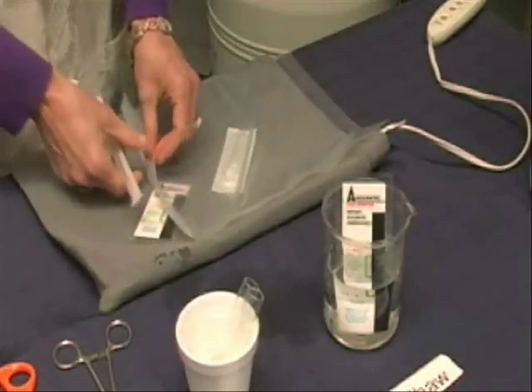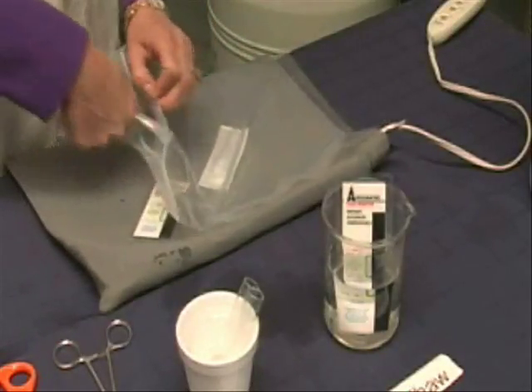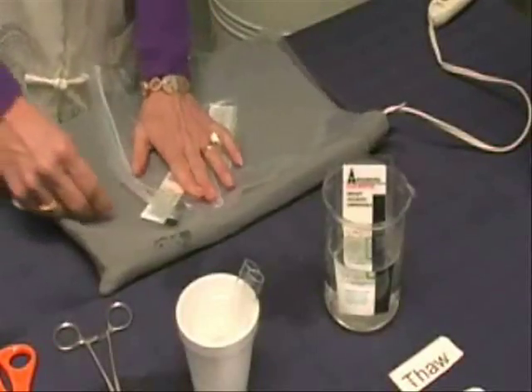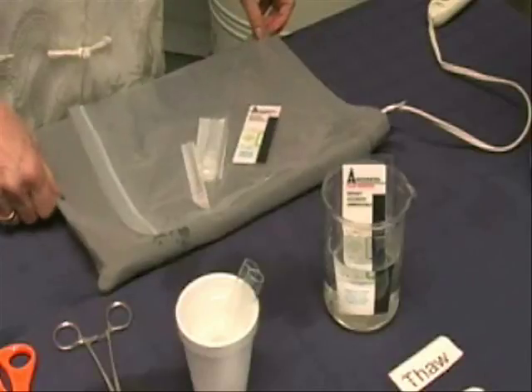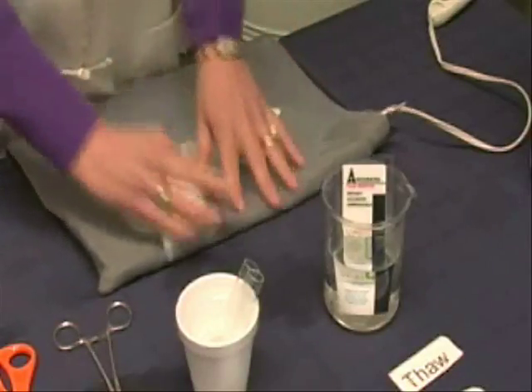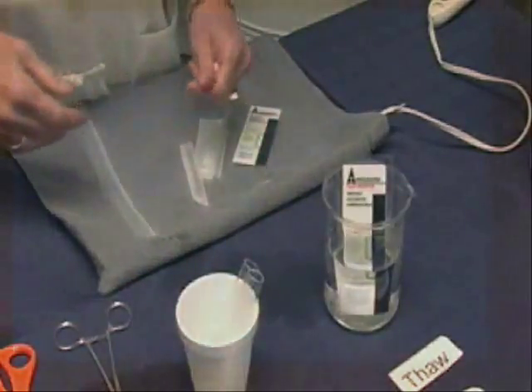This is important. Warm insemination rod, syringe, and needle on the heating pad. Set on low heat or in 98 degree Fahrenheit incubator. Have all items ready.